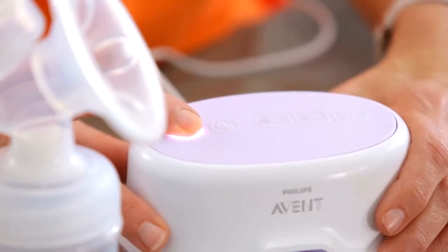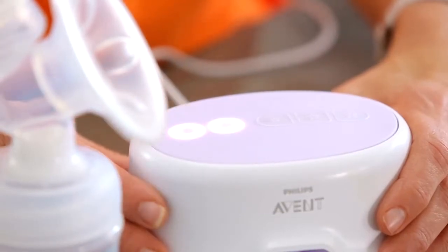Next, press the first button on the motor of your pump. This will turn it on. As soon as it's turned on, it will go into the stimulation mode and you're ready to express.